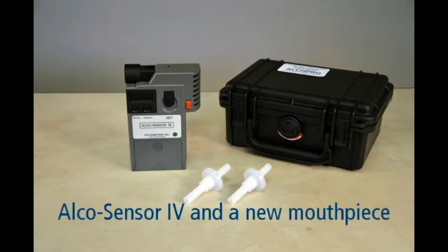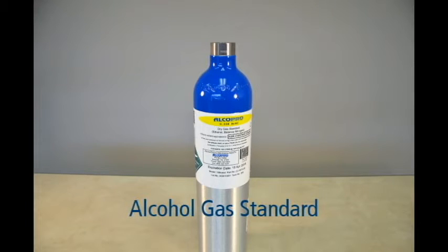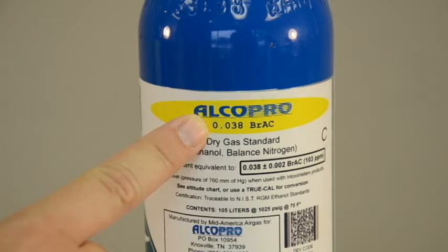Your AlkaSensor 4 device and a new mouthpiece. The function switch key that came with your device. You will need an alcohol gas standard. We will be using a dry gas standard with an ethanol content of 0.038 BrAC at sea level.